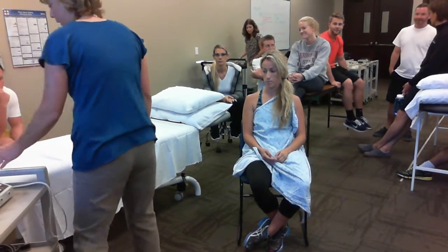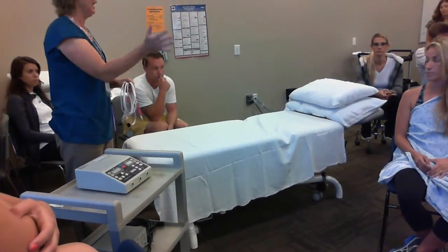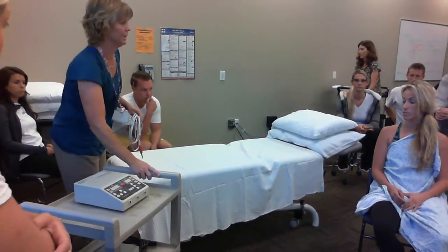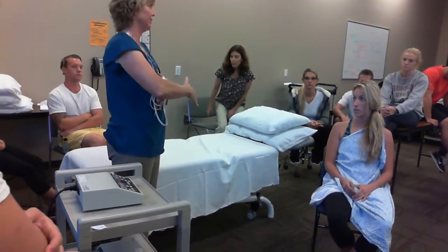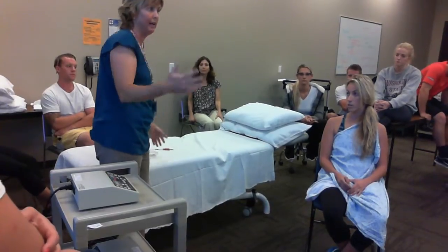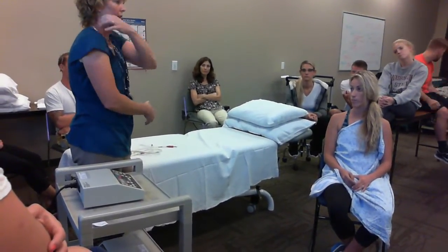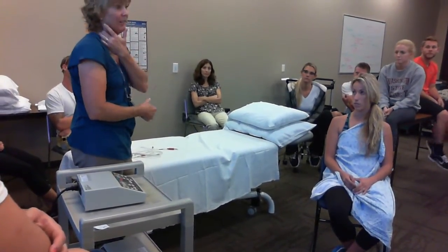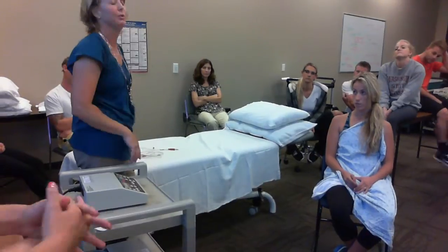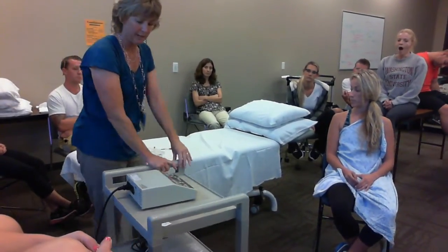Now, for the stimulation, I'm going to do the setup sitting, and then I'm going to have her lie down afterwards because it's much more comfortable when you're having shoulder pain to be really well supported. Oftentimes people with shoulder pain, especially post-surgical, have a lot of neck pain that goes along with it. So if I've got electrodes on her and a big cold pack on her, that's going to be weighing her down, and that might even cause more neck pain. So if I can get her supine, if I have a plinth available in my clinic, I would use that when I get her set up.